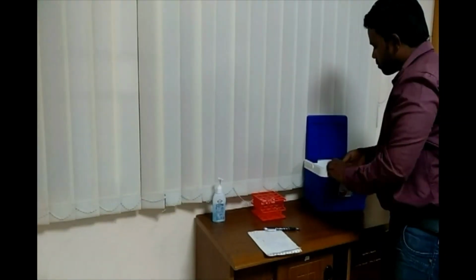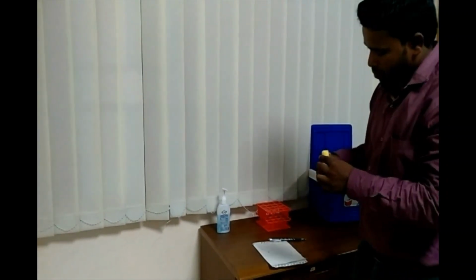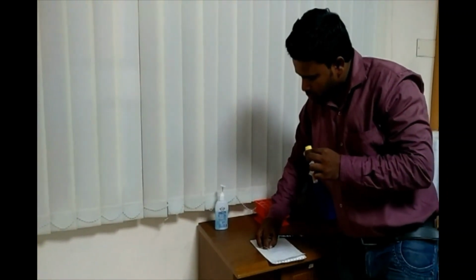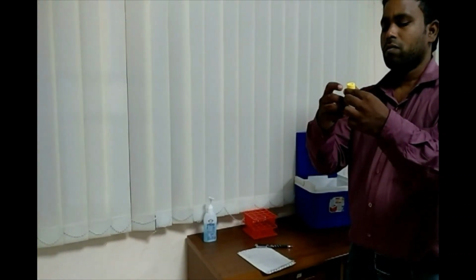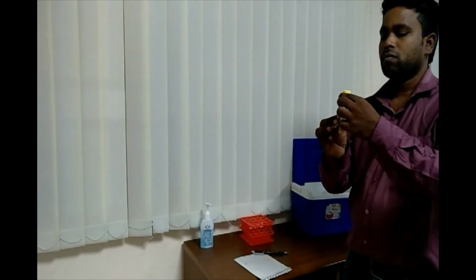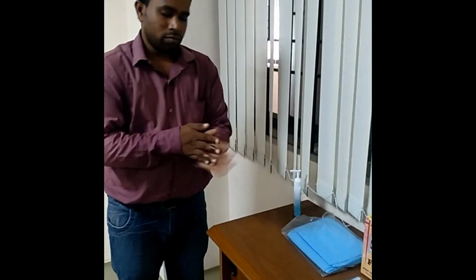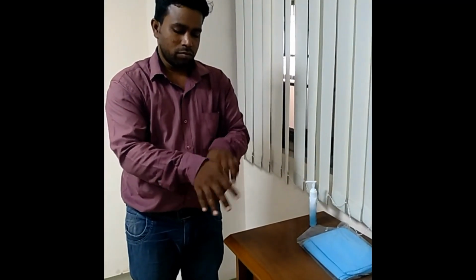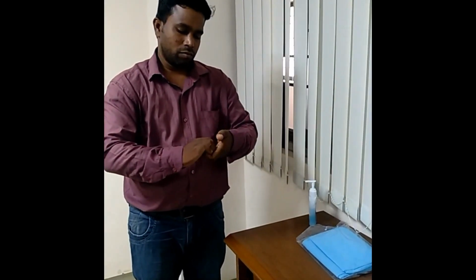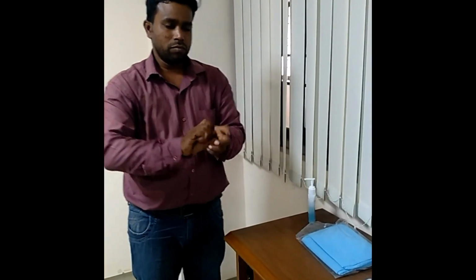Remove the VTM vial from the cool box, maintaining 2 to 8 degrees centigrade. Label the VTM vial with date and patient ID and any other information as may be required. Wash your hands thoroughly with soap and water or alcohol-based hand sanitizer prior to sample collection.